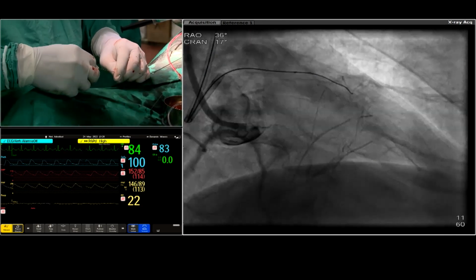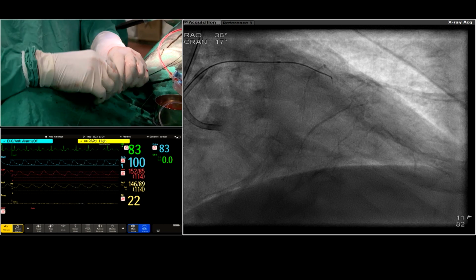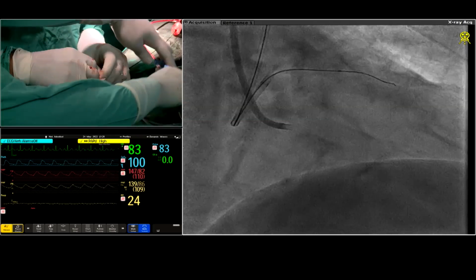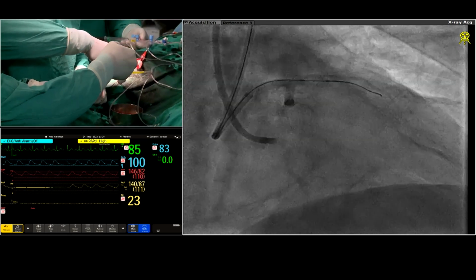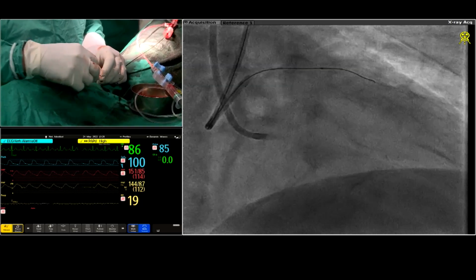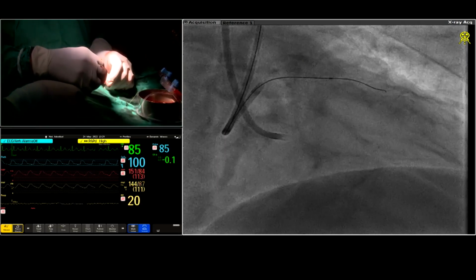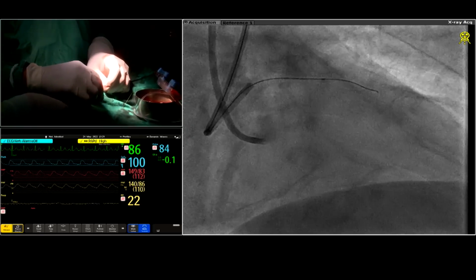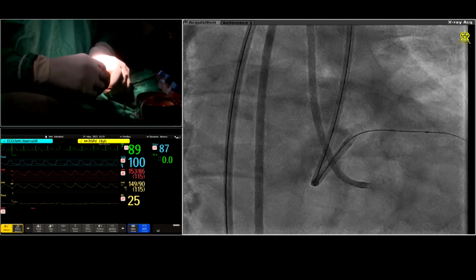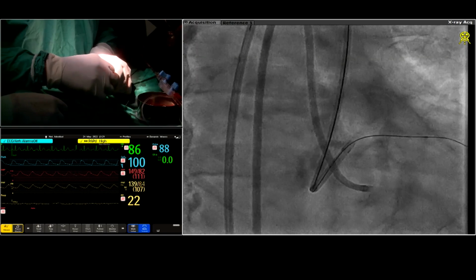Of all these 5 scores, ये सीख लो. लेफ्ट इंजेक्शन करो जरा. करो. कहाँ है थोड़ा टेबल अन लो. कहाँ है ये बैग, अभी आया नहीं आया? इसके अंदर आ रहा है ना? आ रहा, it is coming.